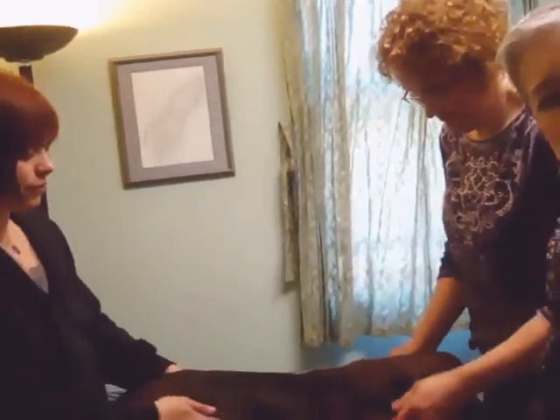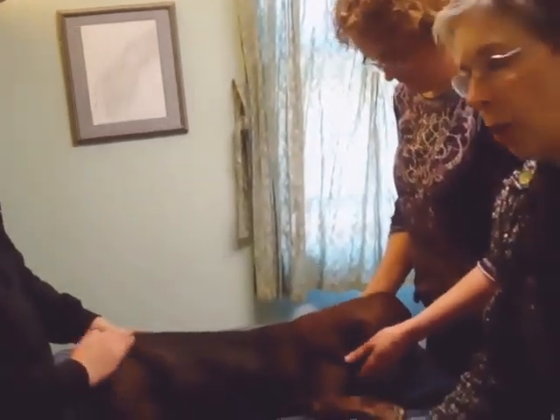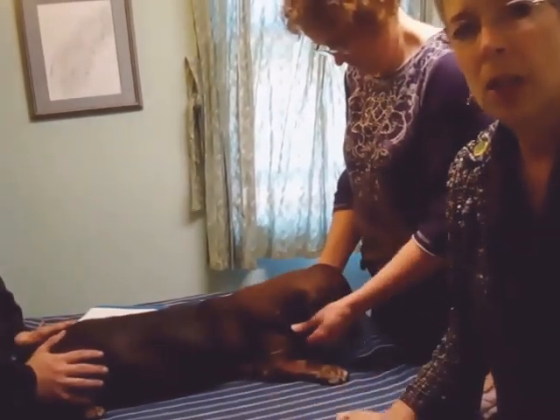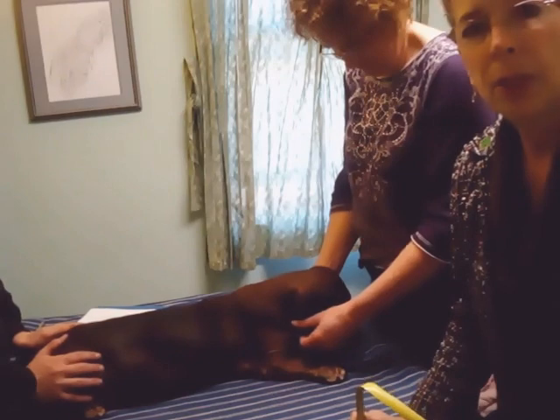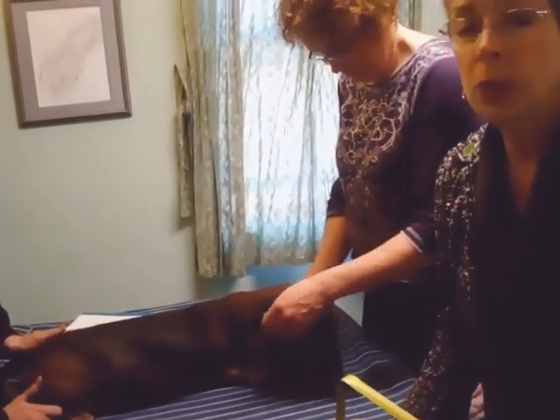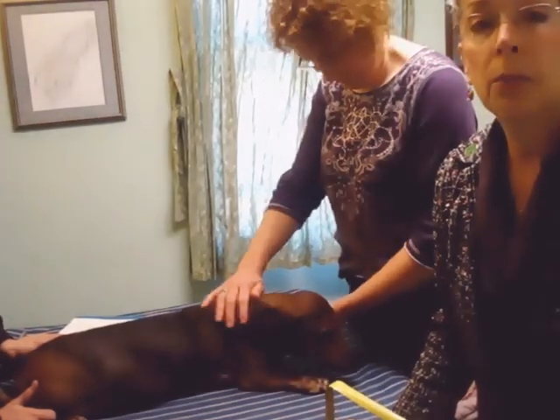This is a video about how to measure a dog for a full quad cart. We have here a 14-year-old dachshund with a cervical issue, a laying front leg, and arthritic rear, so a quad or front wheeler would be the best solution for him.